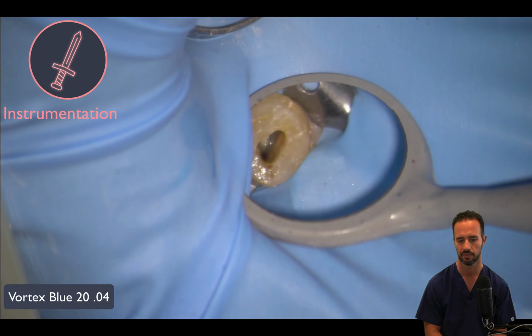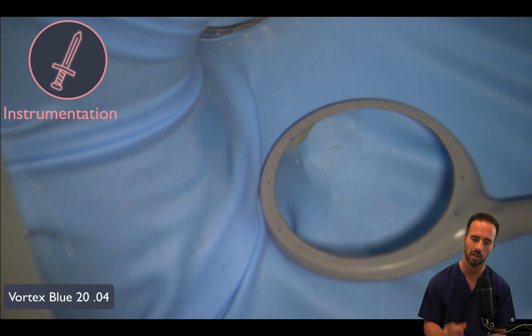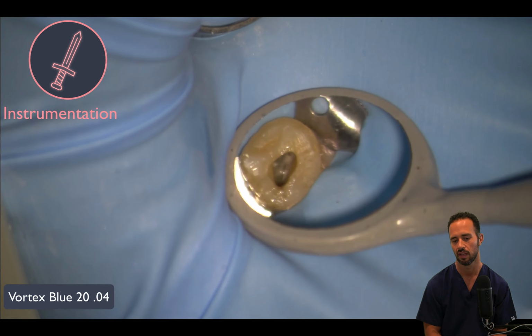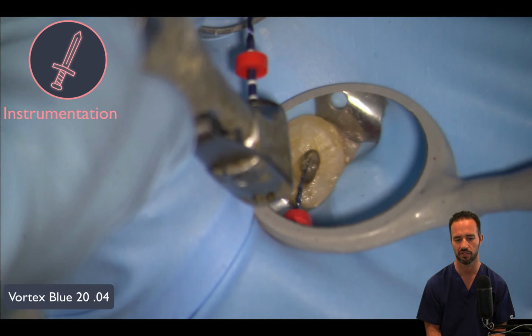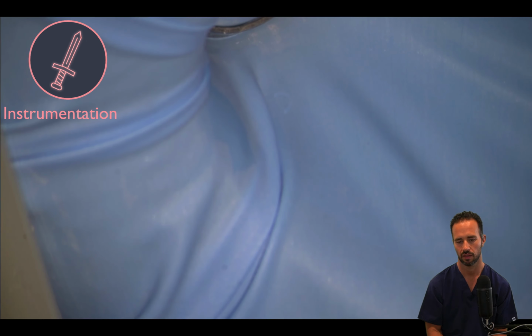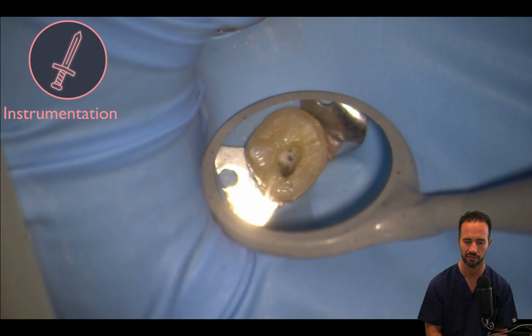That's great. You can see that visualization, once you've got the rubber dam on and you have the bite block in the patient's mouth, is pretty good. You should be able to see, even though this is an upper second molar, the light required to do proper endodontic treatment is sufficient here, and we can see everything we need to see internally. That looks good. Working our way up. Now we're going to get into utilizing the size 25 in just a second.